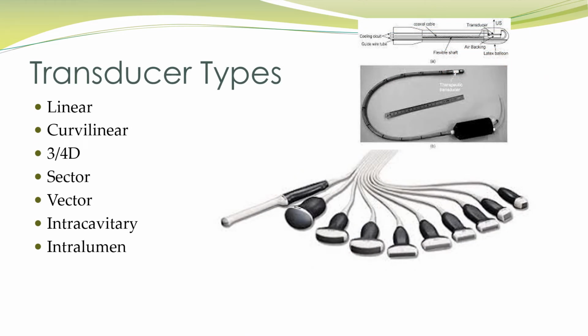That brings us to our different transducer types. So here, this is an image of a bunch of different transducers. I think this group was made by GE. And in this group of transducers, we see a number of different linear transducers. These are all linear transducers. They just have what we call a slightly different footprint, meaning this one's longer, its footprint is larger, just like a larger shoe size would have a larger footprint. This one's smaller, and then we have in between. They can also be linear with the same sort of shape, but have a different frequency, so they might operate better on certain specific exams.